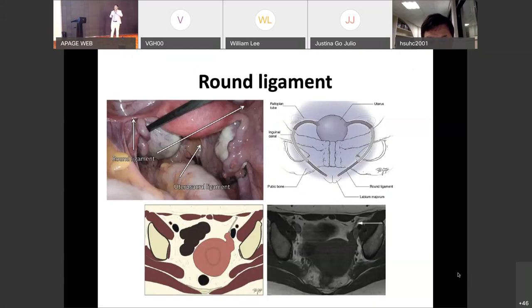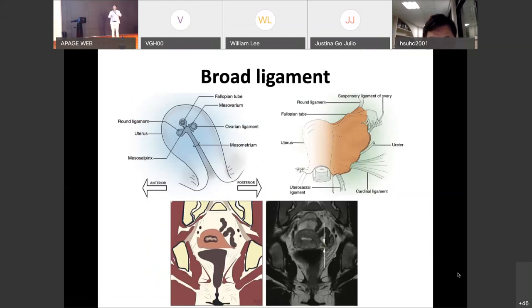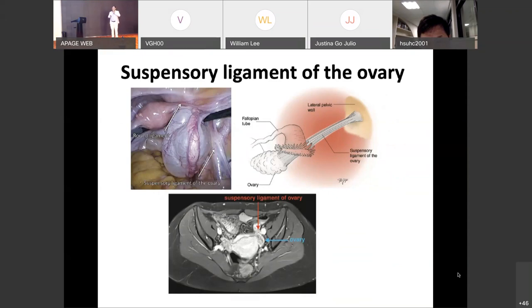The third structure is the round ligament. While it can be appreciated clearly on the laparoscopic video, on MRI it is actually a very delicate structure linking the parametrium to the anterior pelvic wall. On T1-weighted MR imaging, all tissues are outlined by fat, and you can see the linear structure connecting anteriorly in the left pelvic cavity — that is the round ligament. The fourth structure is the broad ligament, which covers the entire uterine structure. On MRI it appears as only a very thin layer, and we can trace any pathology on its surface using T2-weighted coronal imaging.